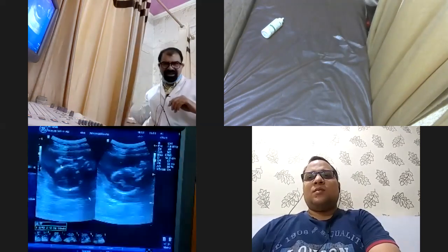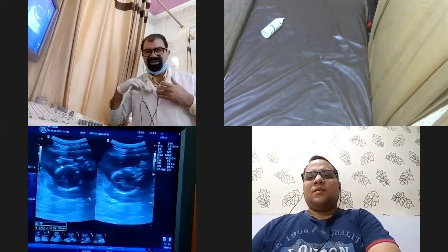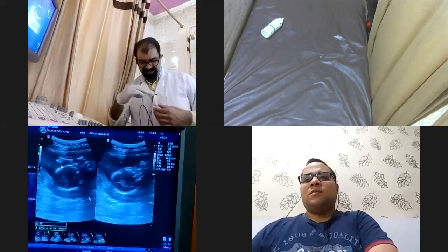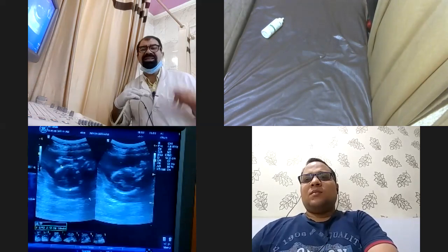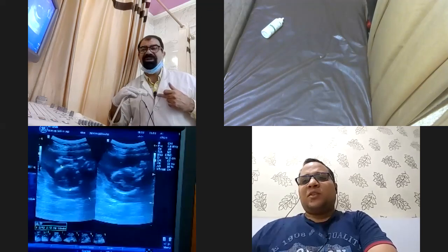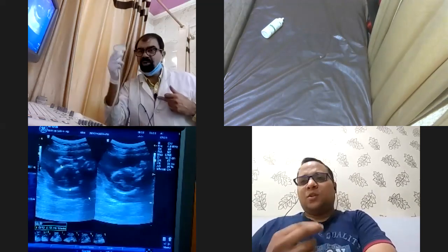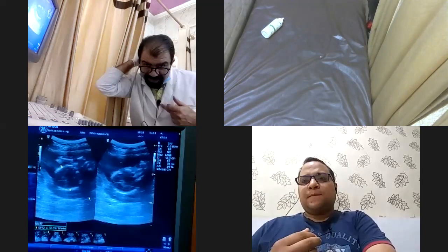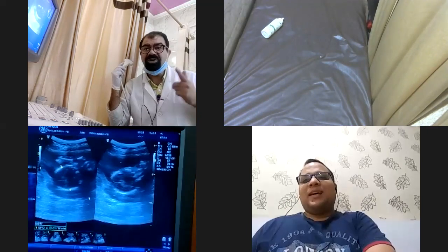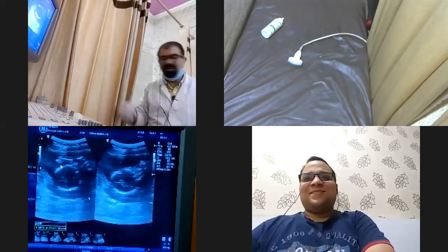Now, coming to your confusion. If I am putting this probe over here, whatever I am hitting over here, not this shirt. Now see this mic over here. This marker will be on the top or in the bottom of the screen if I put the probe over here? On the top of the screen, sir. Now this probe, if I put it on my back and scan from the back side, where will this point be, on the top or in the bottom? In the bottom, sir. Have you got your answer? Yes, sir. God bless you.